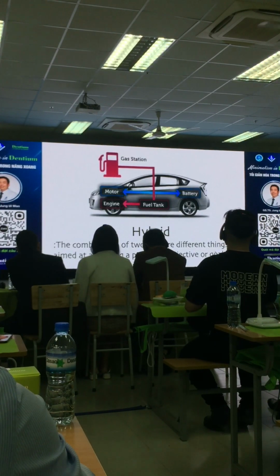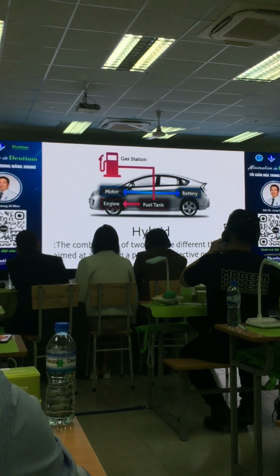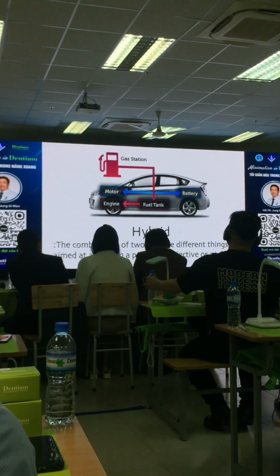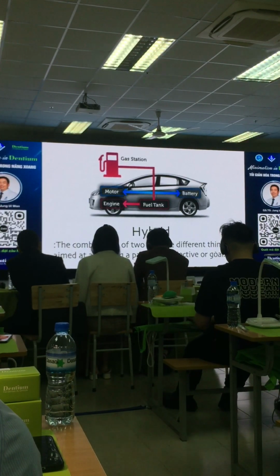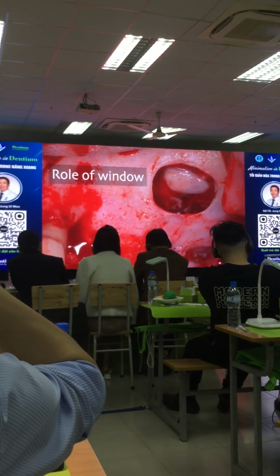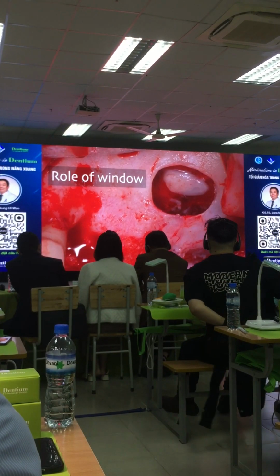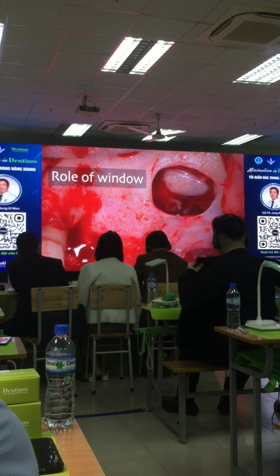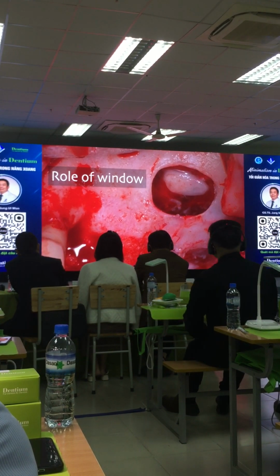The definition of a hybrid is the combination of two or more things for some synergy. As said previously, combining the advantages of the lateral and crestal approaches could produce a synergistic effect. We need to know the actual role of the access window. The first role is a gate for instrumentation. The sinus membrane elevator is accessible through the window. The other role is a passage for bone grafting material.